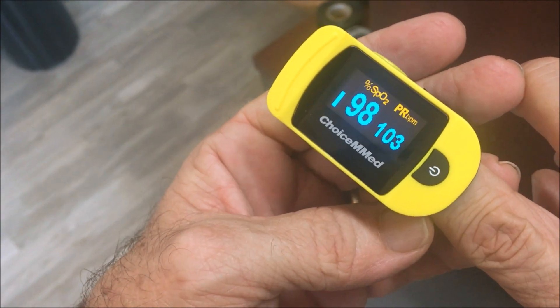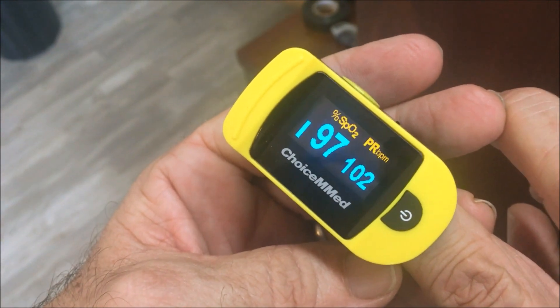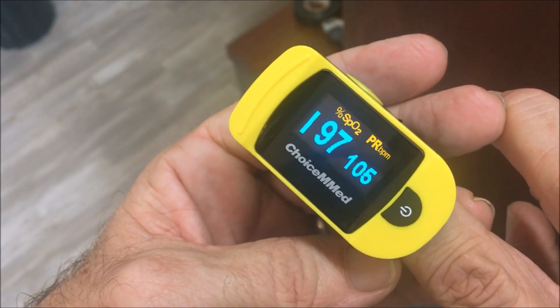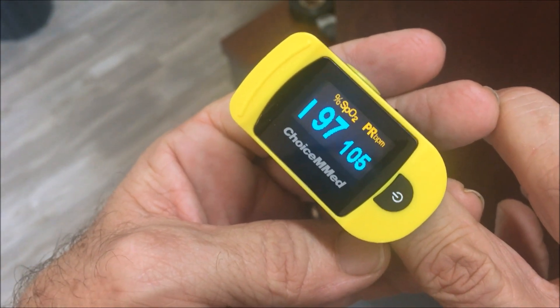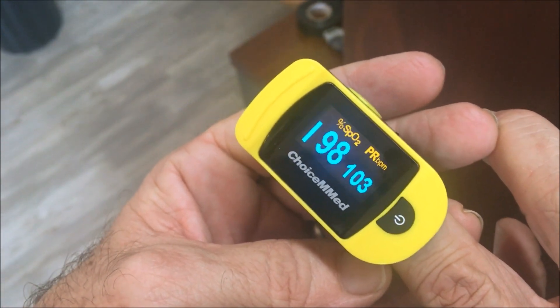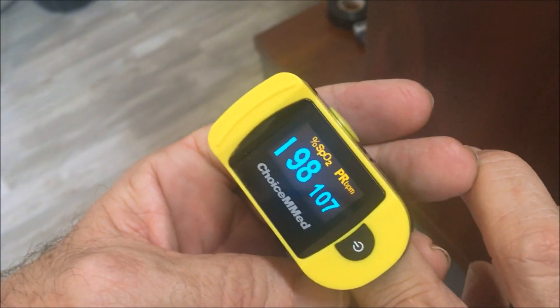As soon as it picks up your pulse, it gives you an oxygen saturation reading — for me it's 98. You can also see my heart rate, which is beating fast — the YouTube video must make me a little nervous! On the left you'll see the pulsating waveform line, which is important because it confirms the device is picking up a good pulse for an accurate SpO2 reading.